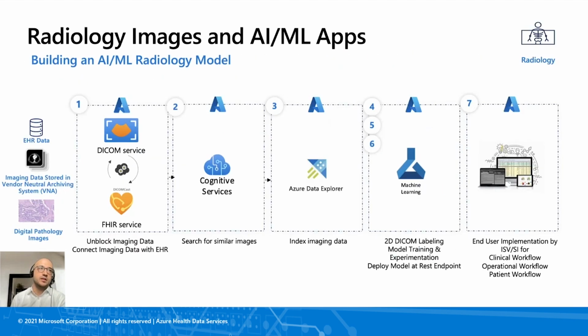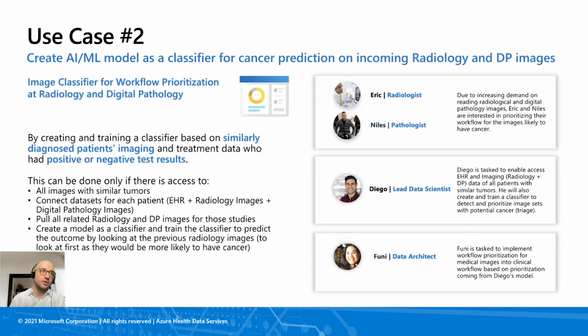So if you look here, those are the steps in this pipeline: your images get ingested with your clinical data, and you are using cognitive search to search for similar images. Actually, before I dive into that, let me give you a quick brief on that.